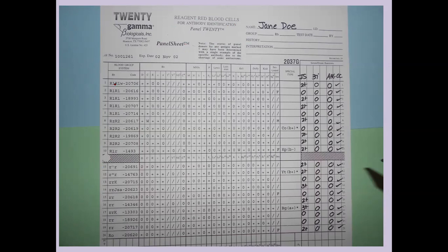When we were talking before about selecting an Rh negative select panel, we could see with this panel that cells 11 through 19 are all Rh negative. They're all little r's. They would be good.